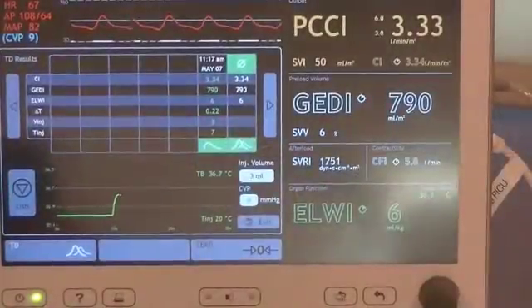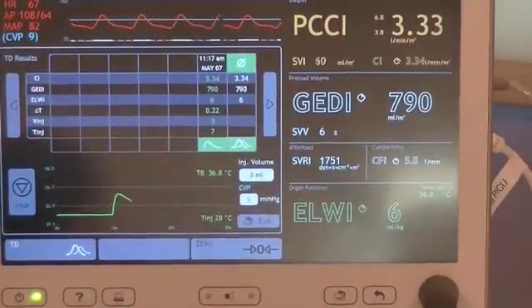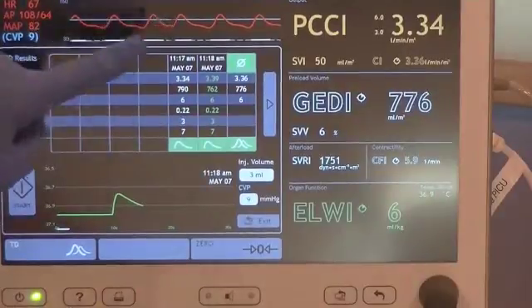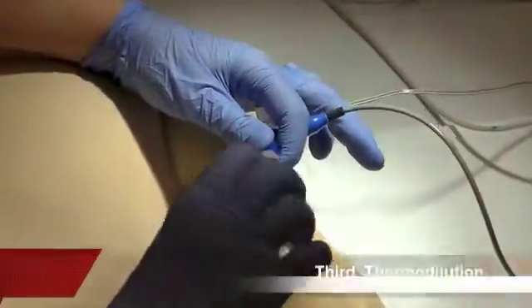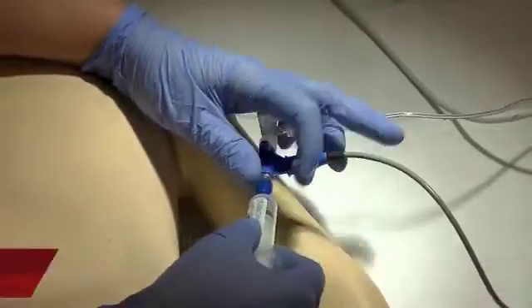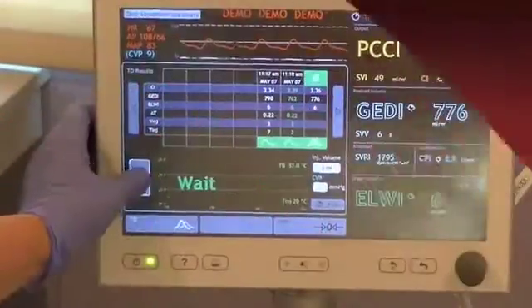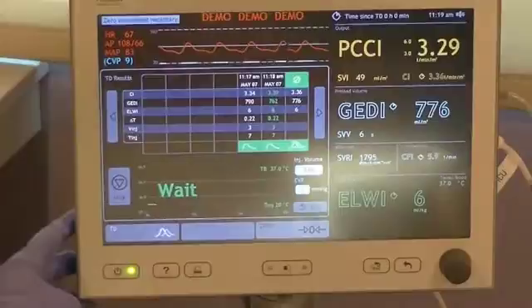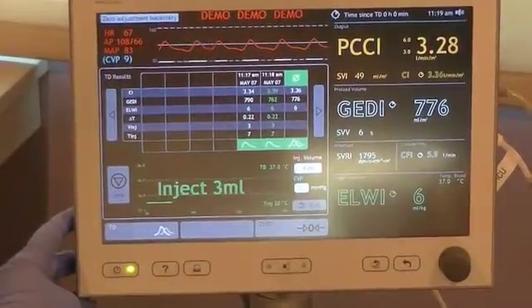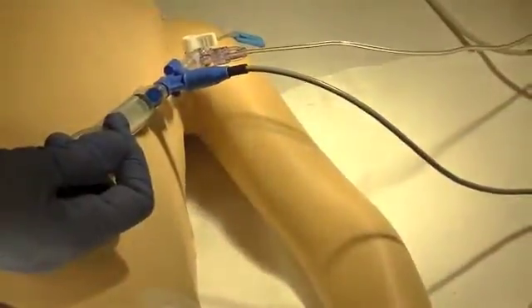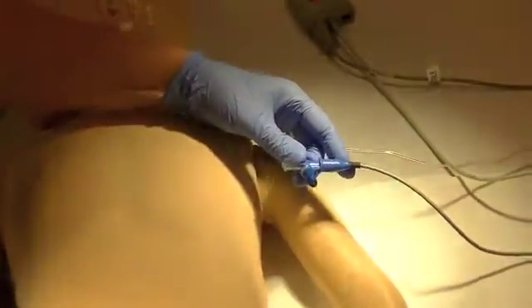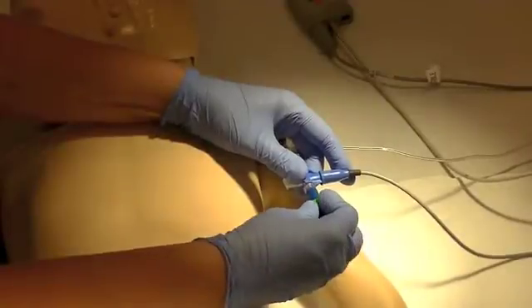Momentarily, the second set of values will then be displayed. Lastly, connect the third normal saline to the end port of the CVL. Press the Start key. After the command, inject the normal saline in a swift and steady fashion. Remove the syringe and protect the end of the port with an alcohol impregnated cap.